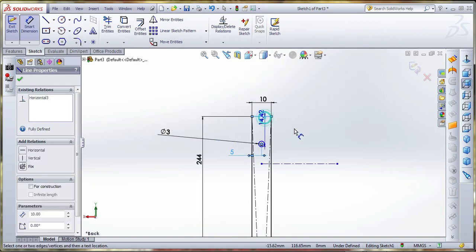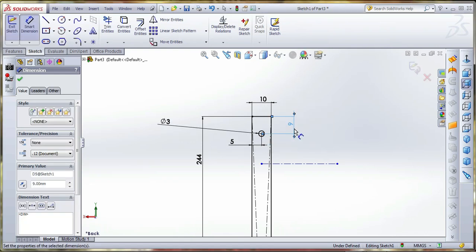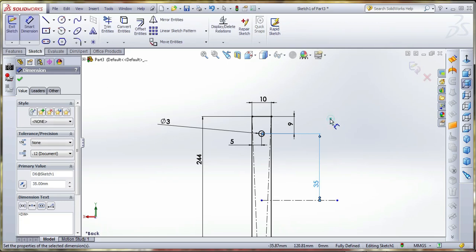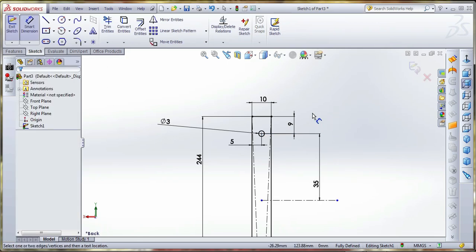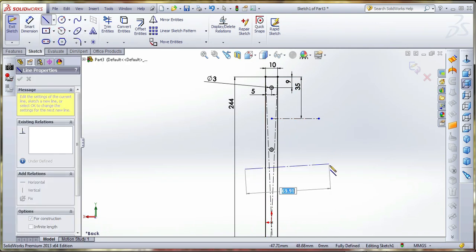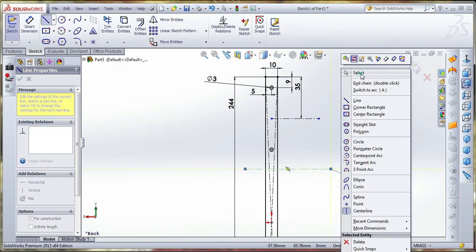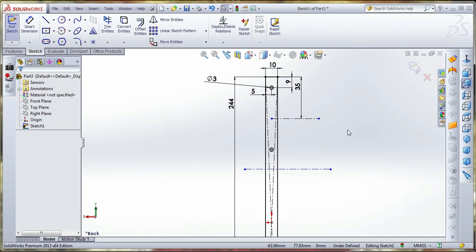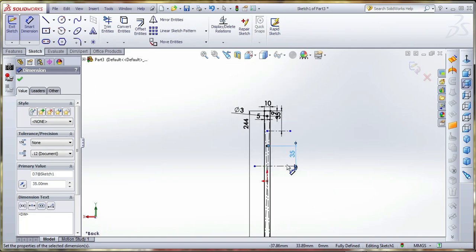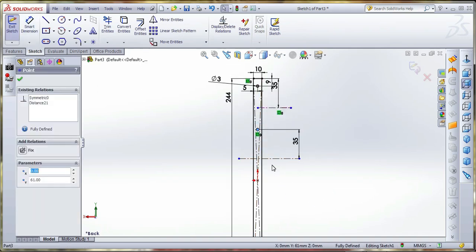Okay. This is 35. Going to make a mirror. We're going to mirror the two circles based on this center line.